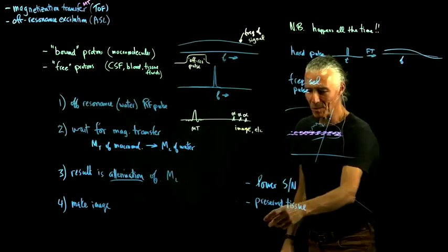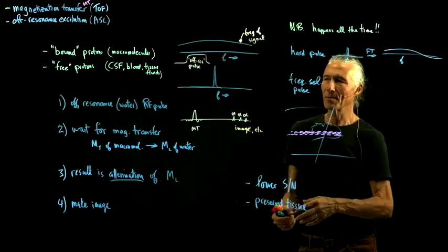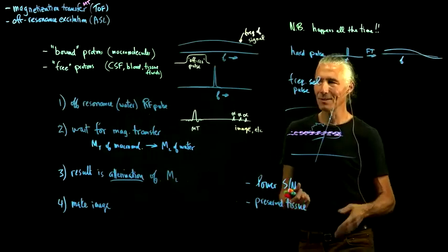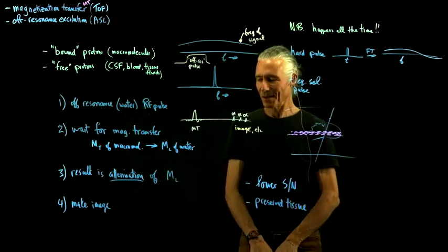I've done some stuff like this with the human cerebellum, for instance, to reconstruct what the cerebellar cortical surface looks like with preserved tissue. And you can scan for hours and days. So that's the reason why you might want to do that. So there's a whole field of scanning dead things.